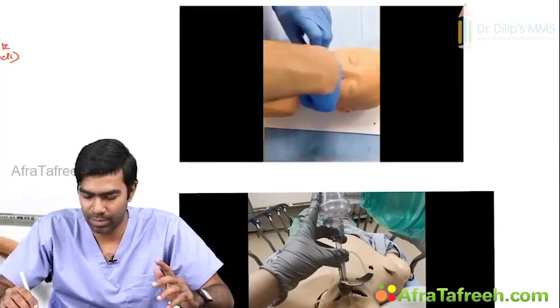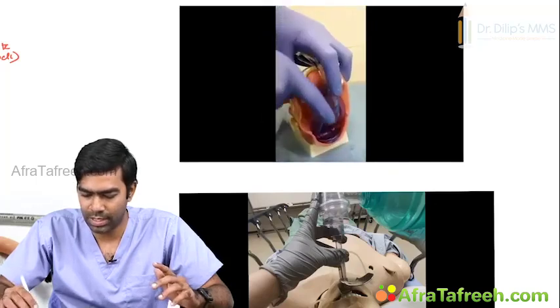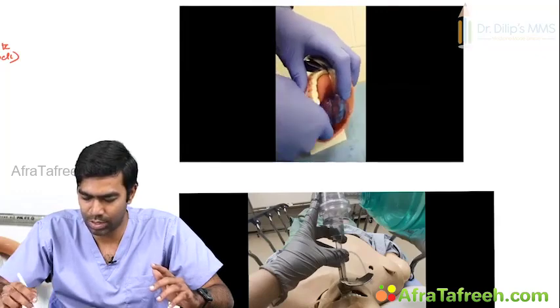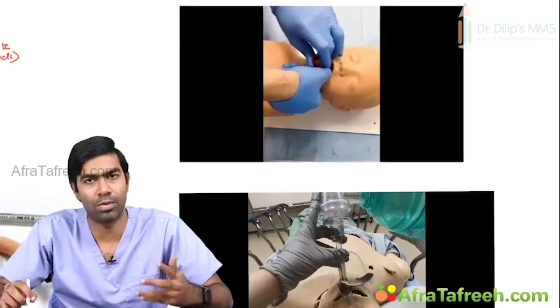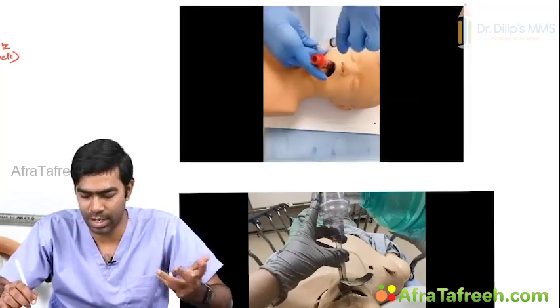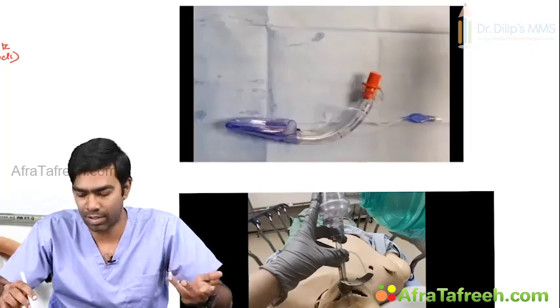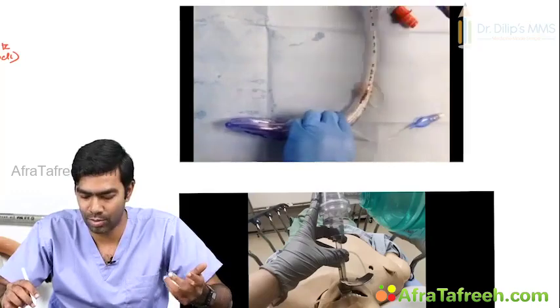This is an LMA flexible, where it is inserted with the help of a finger. But with these kinds of LMAs, one problem is, as shown, you can see there will be a kinking of the distal portion of the cuff, which has to be manually corrected to produce proper positioning. And as usual, since these are cuffed LMAs, you have to insert the LMA, and after that you have to put air in to inflate the cuff.